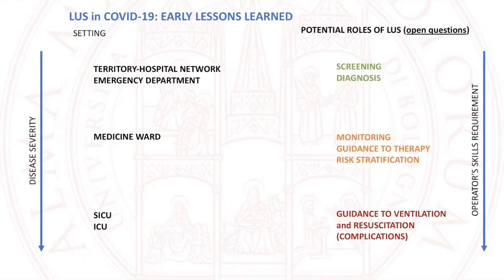For sure, the operator skills requirement in these different settings is different. For screening and diagnostic purposes, sufficient proficiency in lung ultrasound can be reached by quite short training, whereas to use it for these more advanced goals, it requires more expertise and skills for sure.